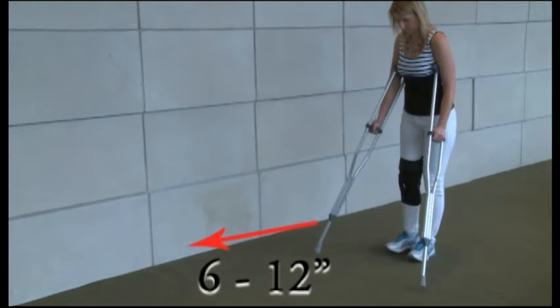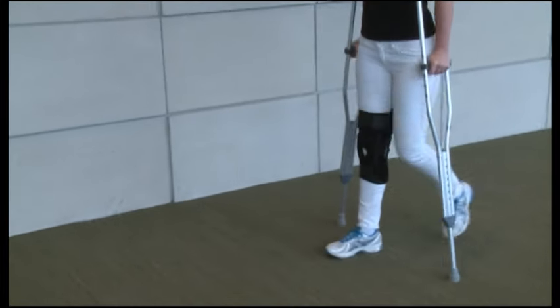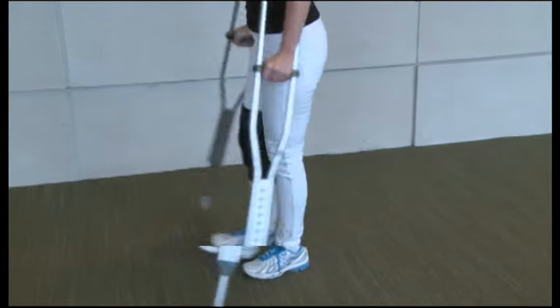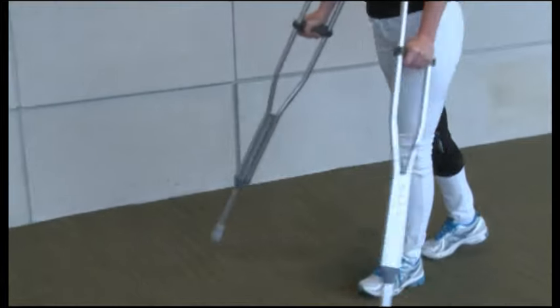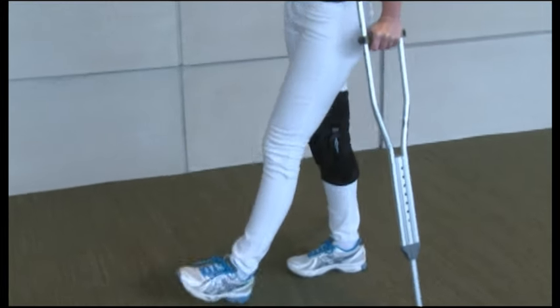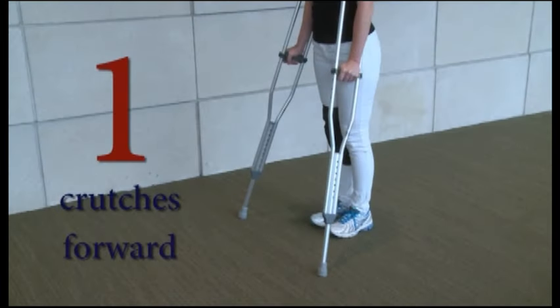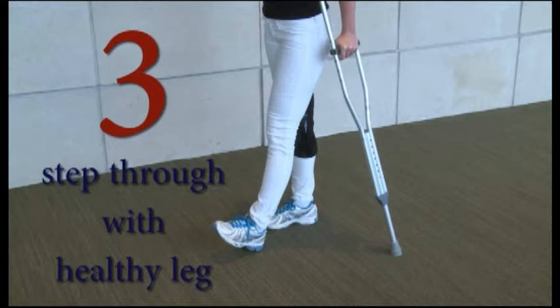Move the crutches forward 6 to 12 inches. Push down on the hand grips as you step forward with your injured leg, putting the designated weight through your injured leg as you step through with your healthy leg. The injured leg always steps through first before the healthy leg. The sequence is: crutches forward, injured leg forward, then stepping through with the healthy leg.